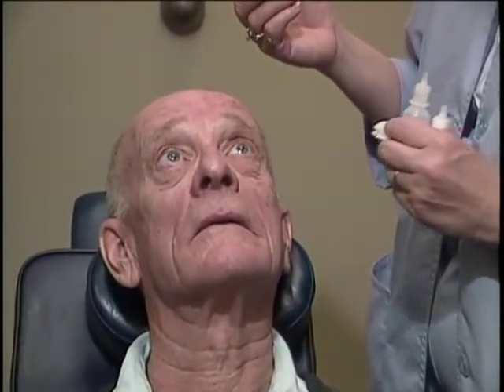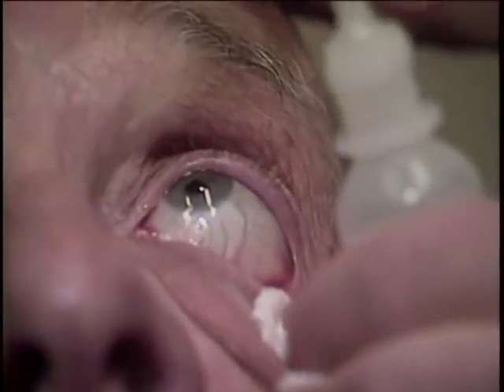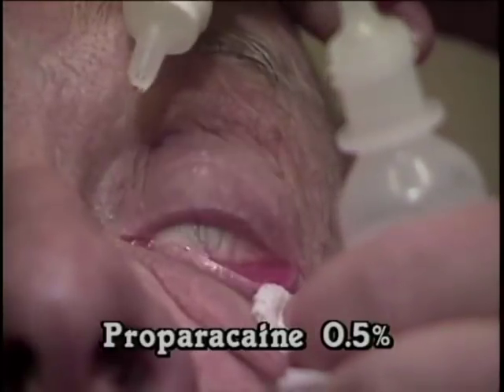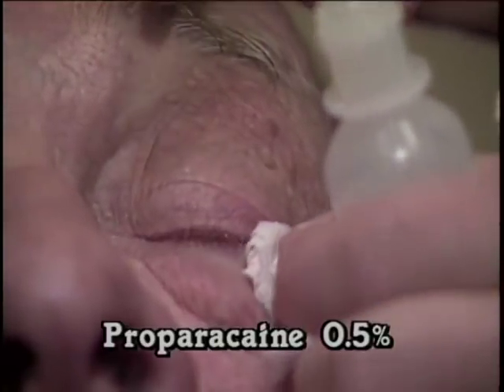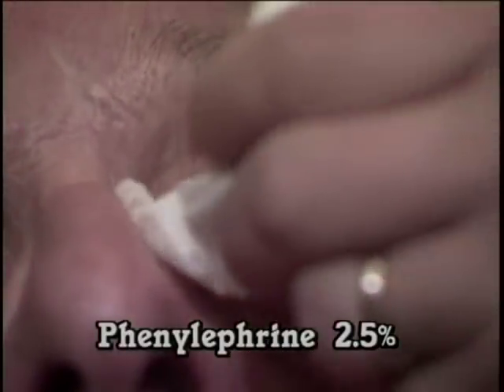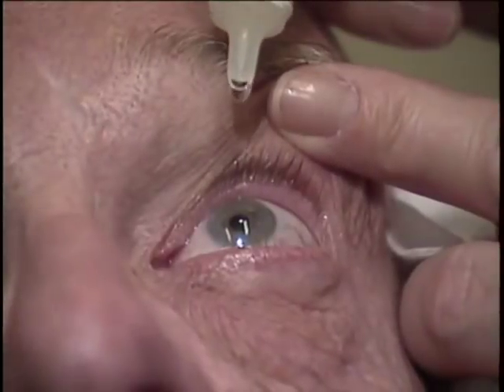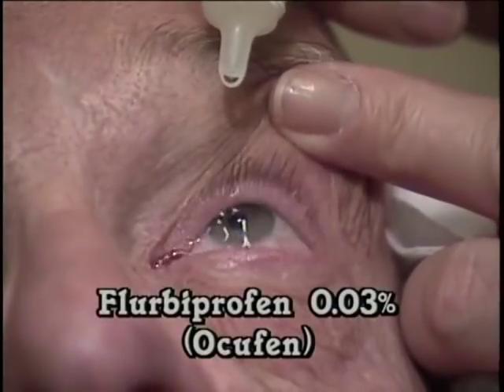I'm going to have you look up at the ceiling while replacing the drops in your left eye. These drops will numb the areas where the injection will be placed, followed by drops to dilate the pupil of your eye.